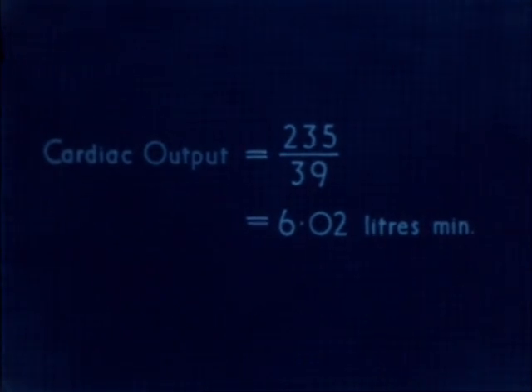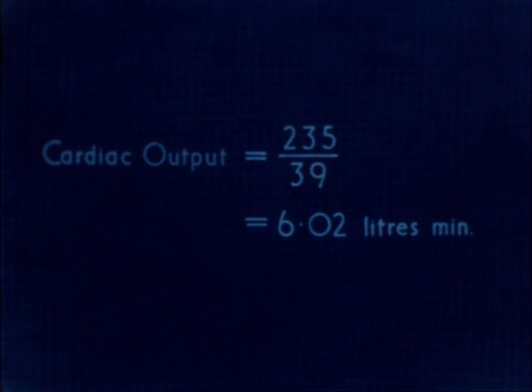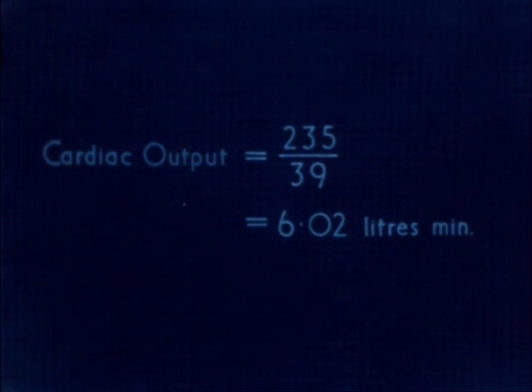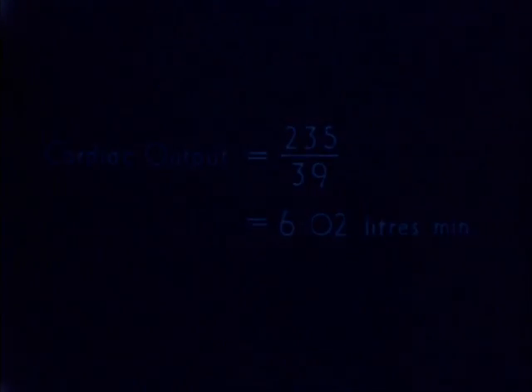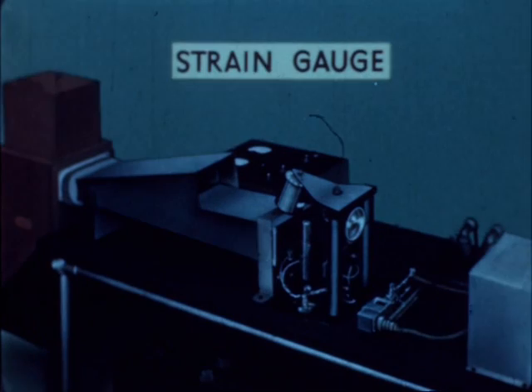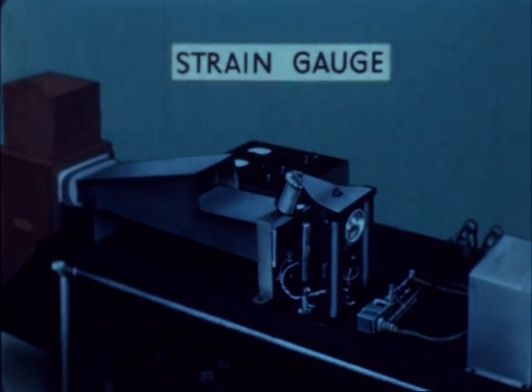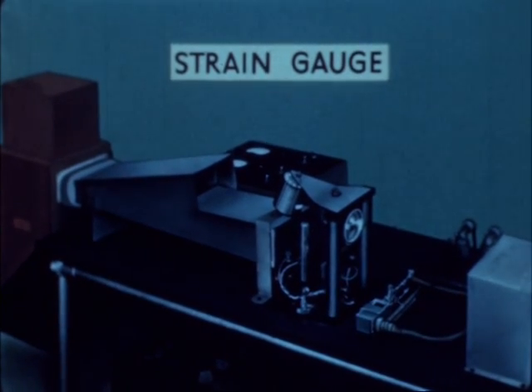As both oxygen uptake and arteriovenous oxygen difference are measured at room temperature, no significant error arises from omission of the usual temperature and pressure corrections. In addition to permitting measurement of cardiac output, the catheter enables us to take optical records of pressures within the heart. One satisfactory recording device is called a strain gauge.